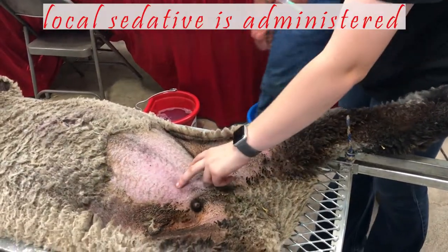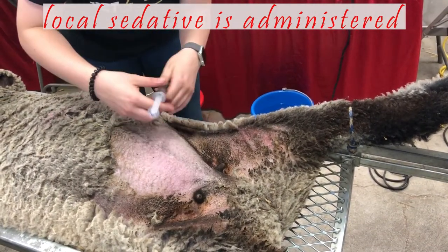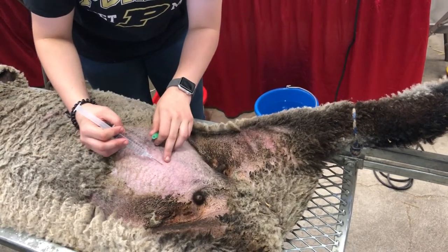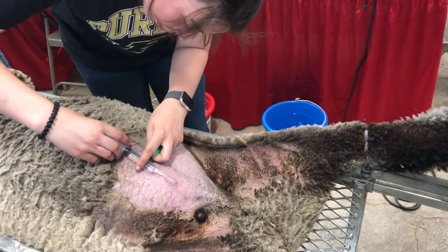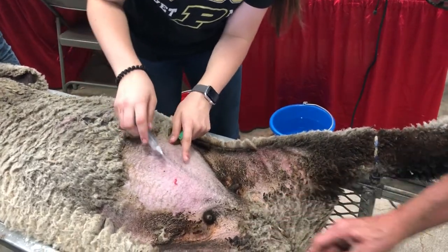We're going to get one cc on each side. You go two inches down the midline and an inch over, so like right here — two, one, sub-q; two, one, sub-q — just right underneath. One cc on each side, and a little blood is okay.